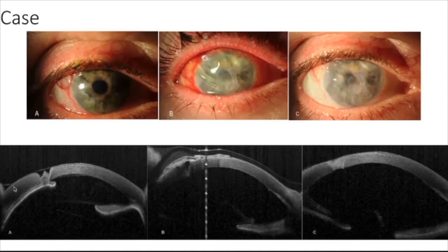This patient, just to tell you the story, had a perforation treated with glue. The glue didn't hold the first time, and the second time it dislodged after 3 days. The second time again it did not hold, and the third time that I saw the patient we tried to do something different, and we did something with the amniotic membrane, and it worked quite well. I prefer the multi-layer one, and I think the reason could be that you can give some substance to the hole, and then hold also on the top.